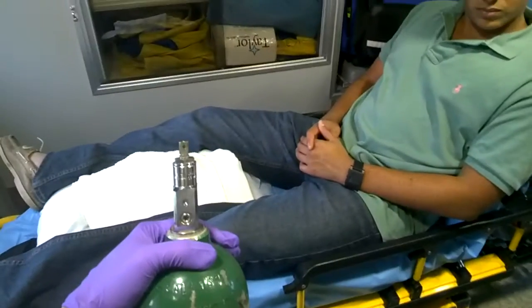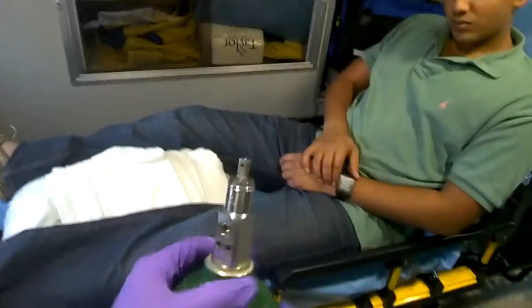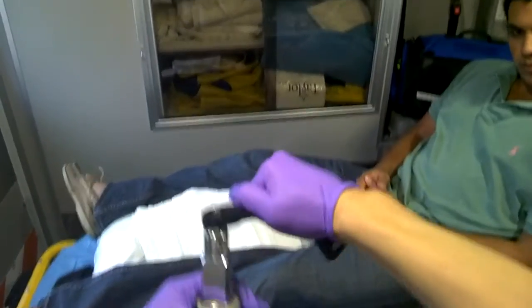Now, the first thing you want to do is crack the tank, which means getting a little bit of oxygen out, and the oxygen should come out through this hole right here. So I'm going to crack the tank, got rid of some of the dust.